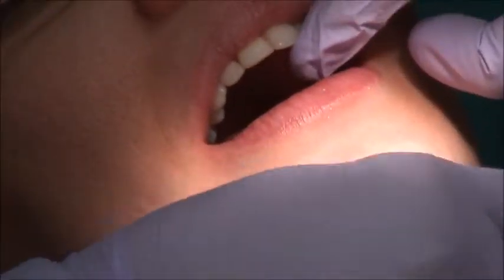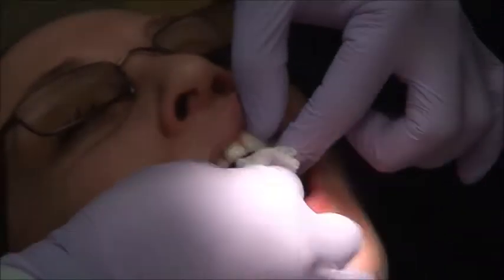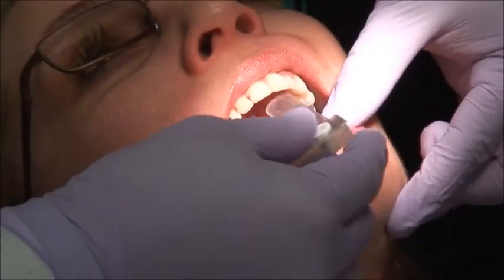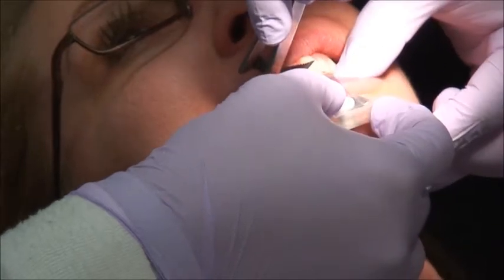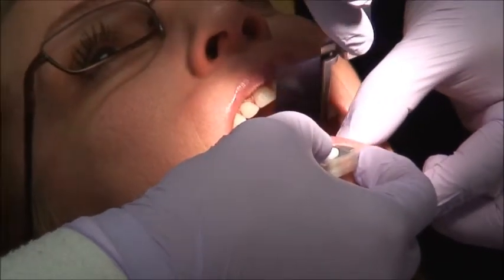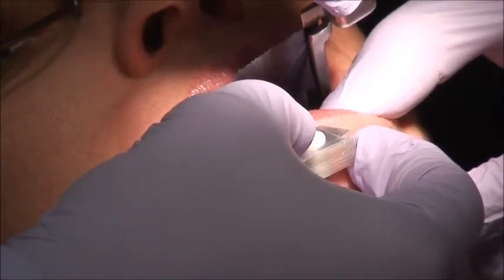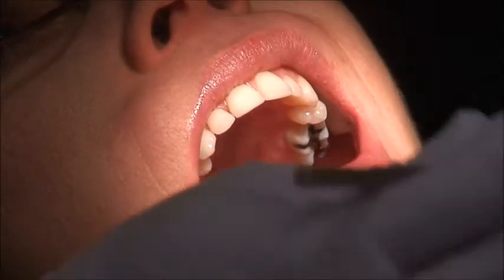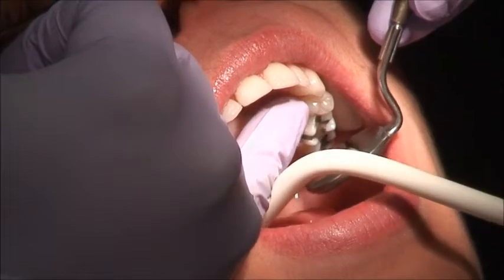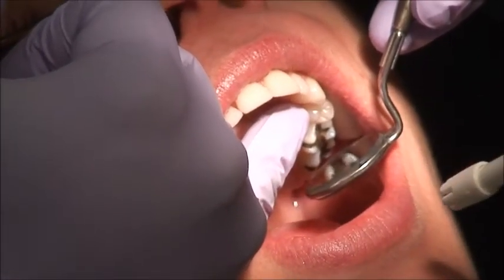Now look — just a little cotton rolls, and we're going to get the first point of contact on the back. Put the paper. Nice. Forward back squeeze. I'll put the other side. Forward back squeeze — open, stay open a little bit. I'm finding the first point of contact on tooth number 12.